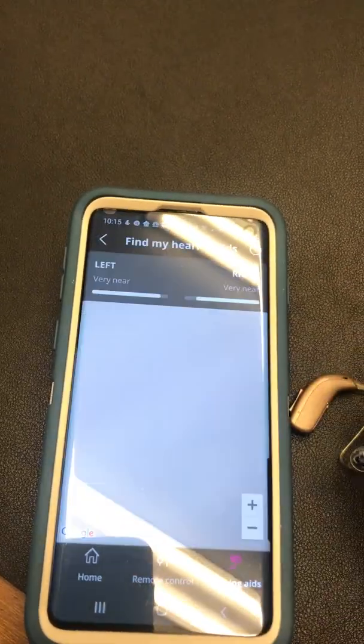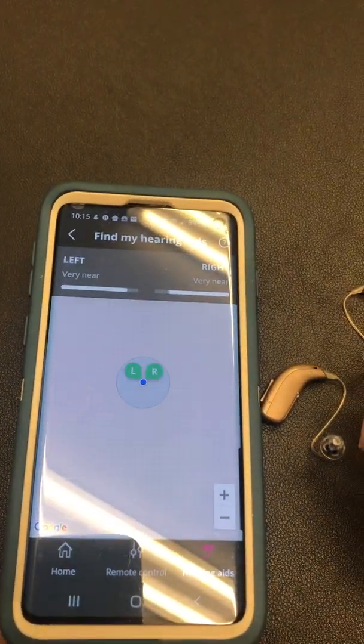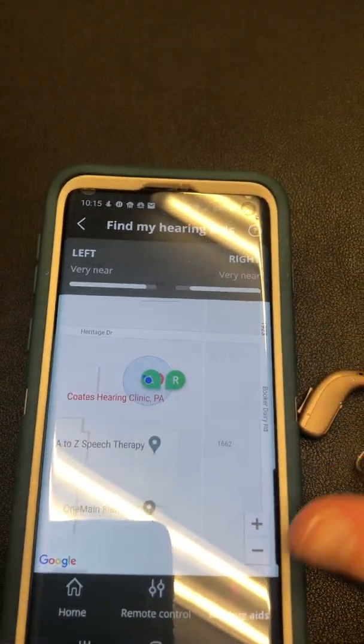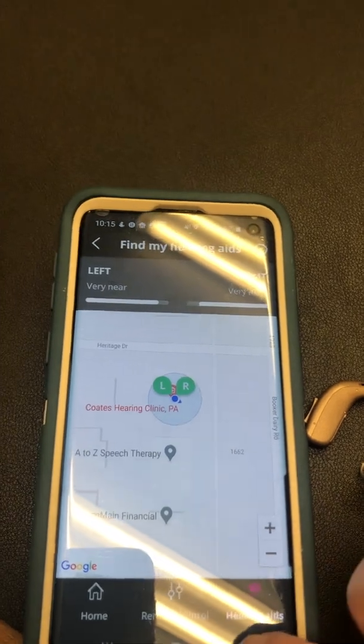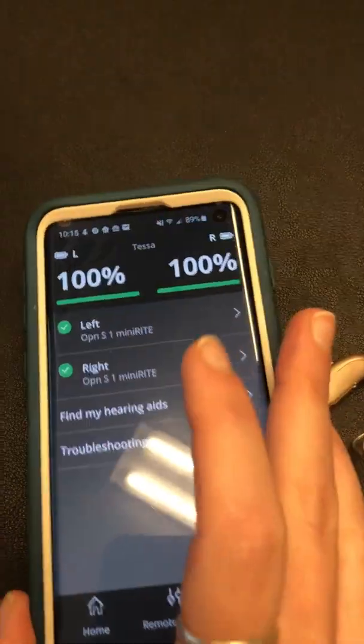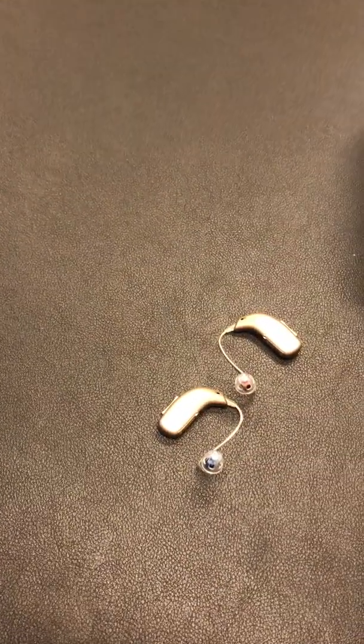You can also use this to find your hearing aids and see where they are if you have lost them. As you can tell, they are in our office at Coates Hearing Clinic. That covers the Android device. Now we're going to go to the Apple device, which is a little bit different.